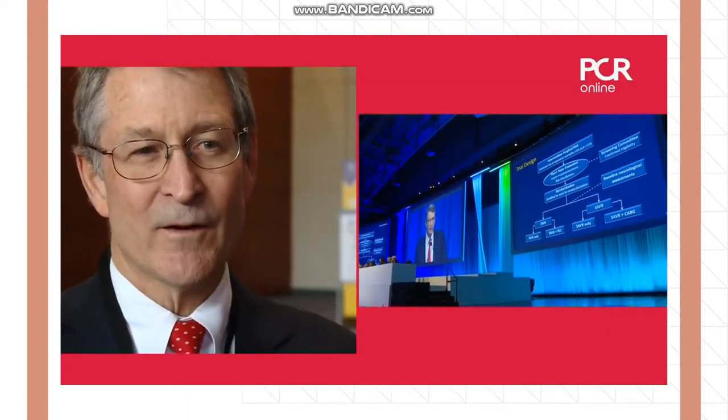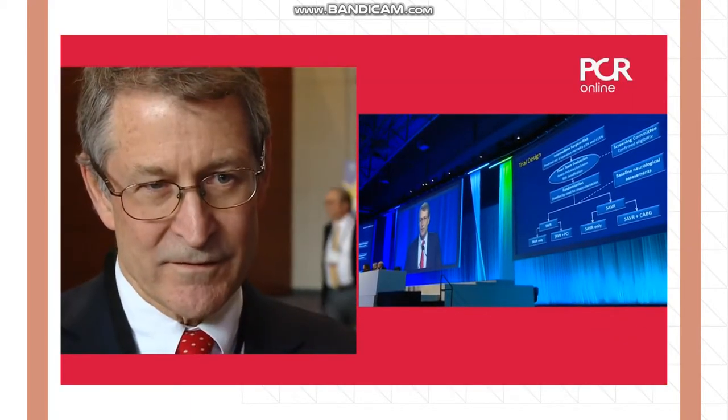The clinical question for the SURTAVI trial was to find out how people with symptomatic aortic stenosis did with TAVR versus surgery, in people that were intermediate risk for surgery, since we had already answered the question for high risk and extreme risk. We randomized over 1,742 patients.